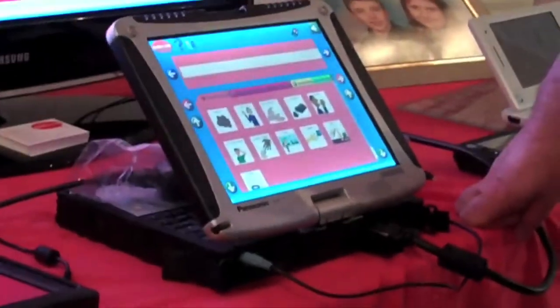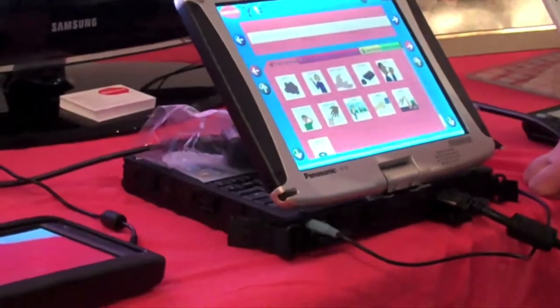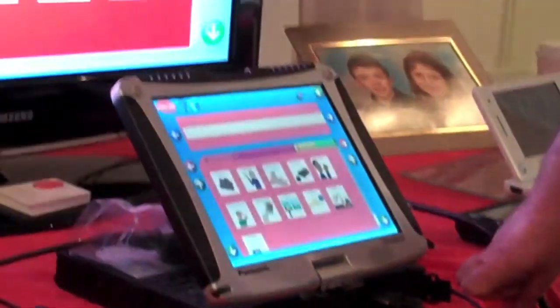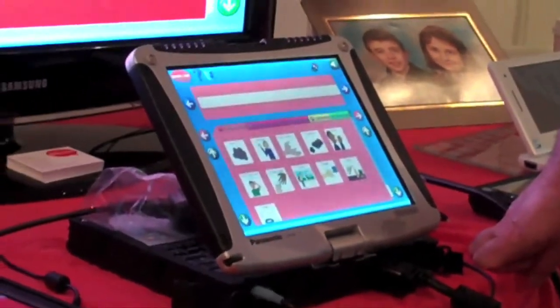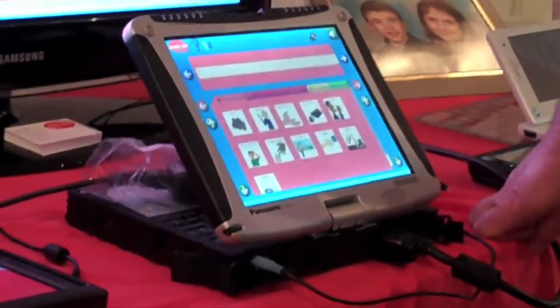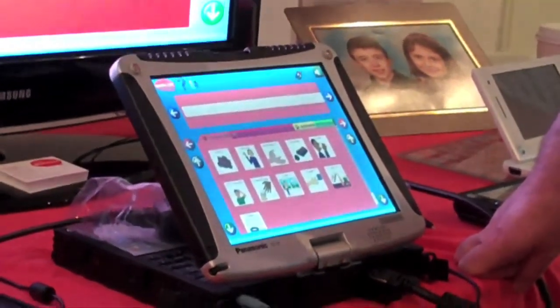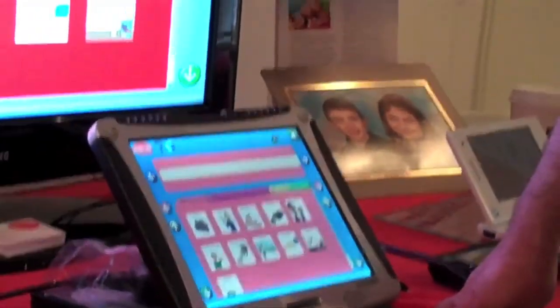I understand what you say. You can customize the range of pictures, type of pictures, and the categories. I'm concerned about the time it could take to make a sentence when you have to select images across categories. Do you have anything that could facilitate the child in order to access the images?